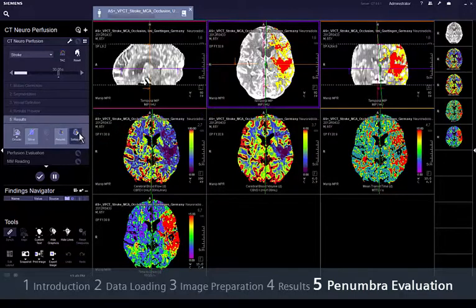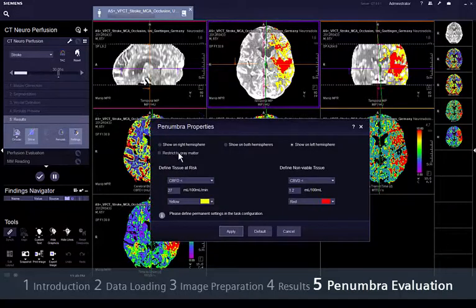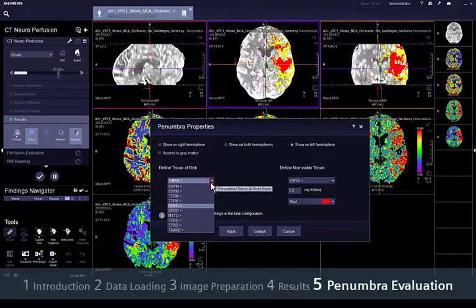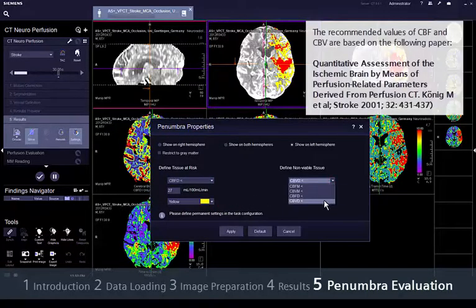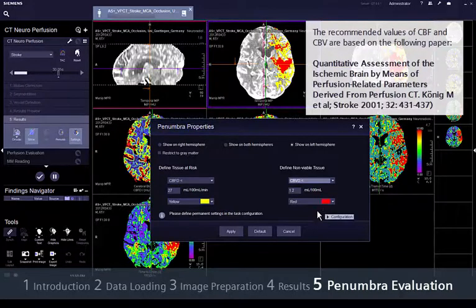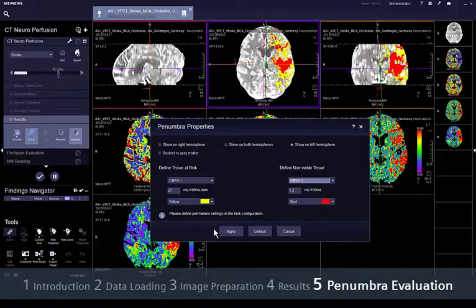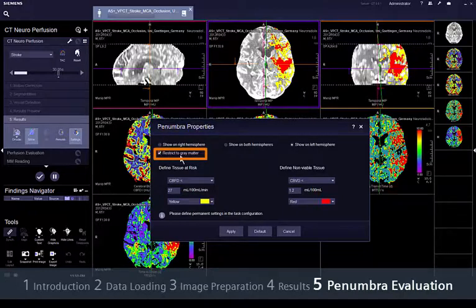Currently, there is no clear consensus about the threshold values. For this reason, Siemens provides some flexibility in the configuration, where you can choose any parameters and thresholds that you want. The recommended values for CBF and CBV are based on the attached paper. In the configuration, it is also possible to restrict the penumbra calculation to the grey matter detected automatically by our refined algorithms.